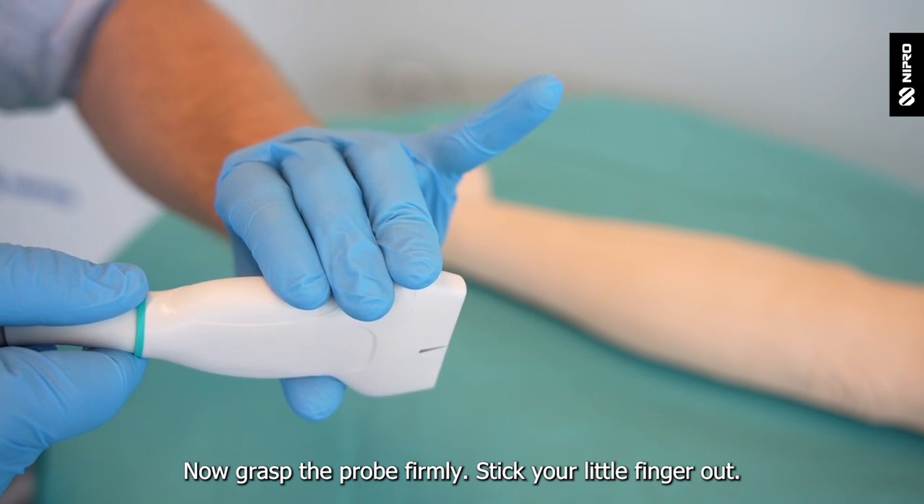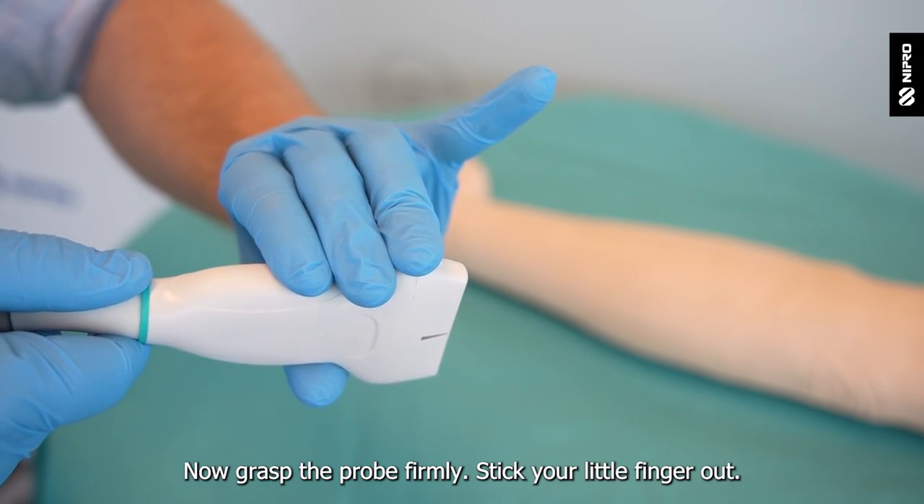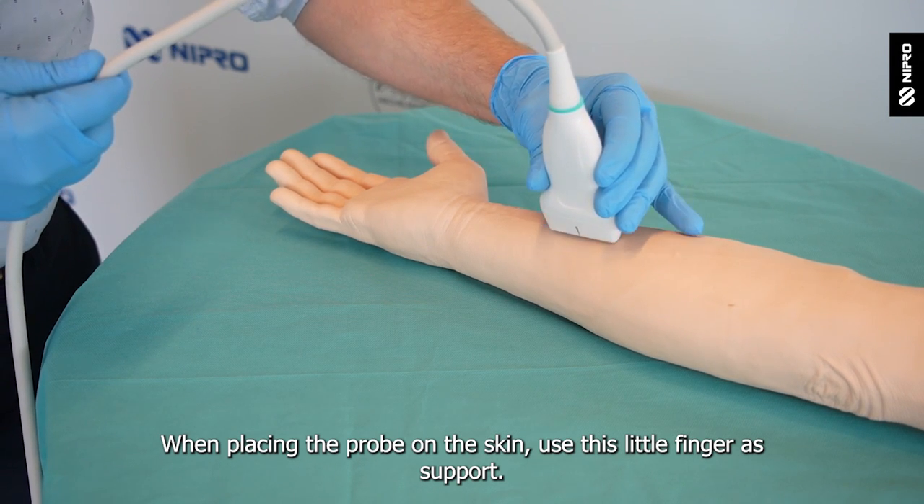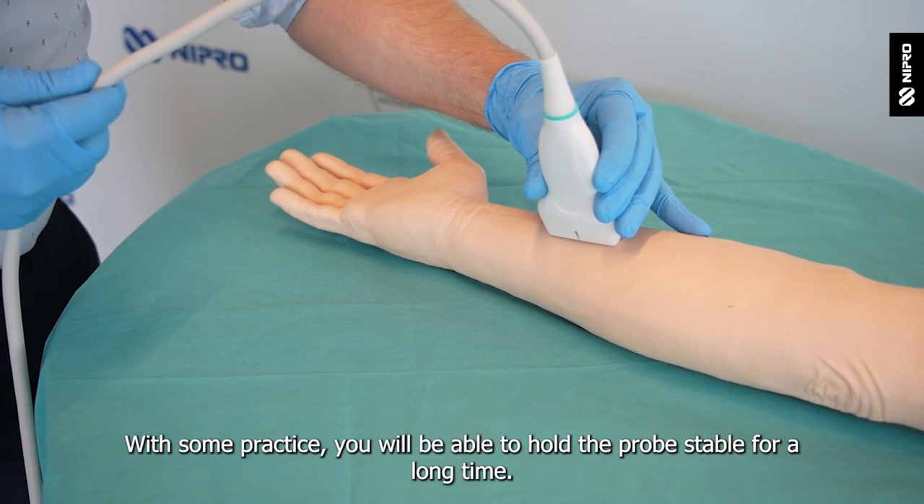Now grasp the probe firmly and stick your little finger out. When placing the probe on the skin, use this little finger as support. With some practice you will be able to hold the probe stable for a long time.